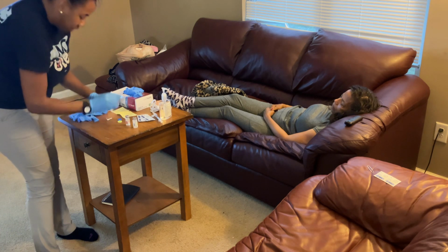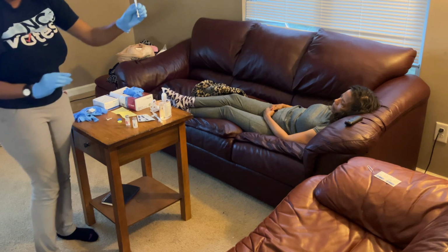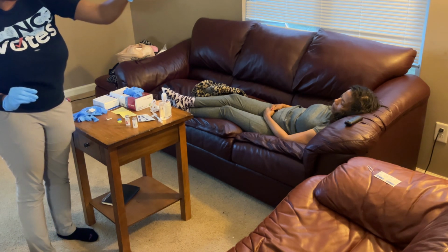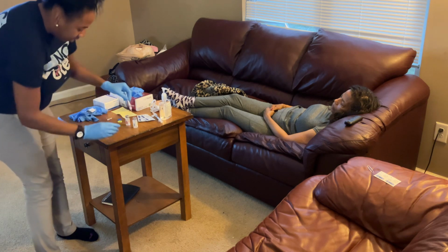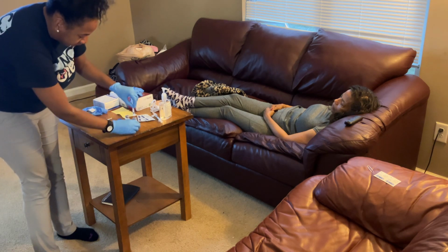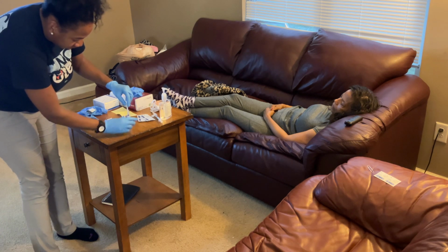I scooped it back up to show my proctor, 5 units. Alright. Now I am going to withdraw 5 units from my cloudy.